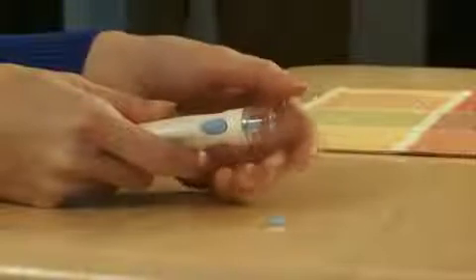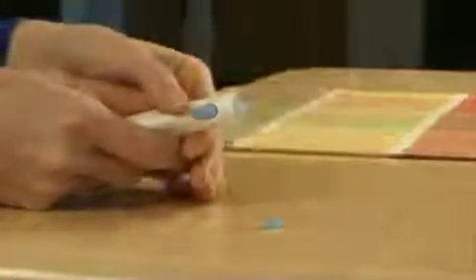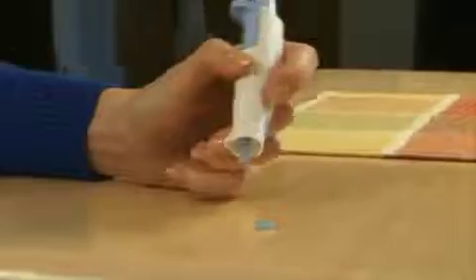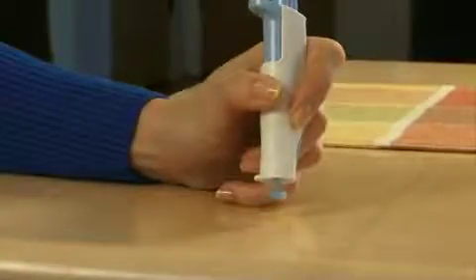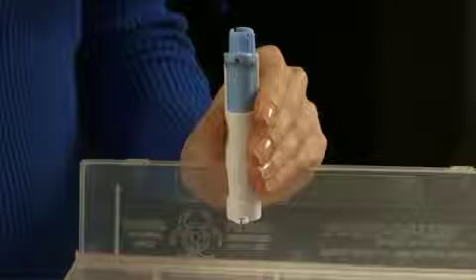To dispose of the lancet, place the lancet protective cap on a hard surface. Remove the cap from the lancing device and push the lancet into the protective cap. Press the set and disposal lever forward and eject the used lancet into an appropriate disposal container.